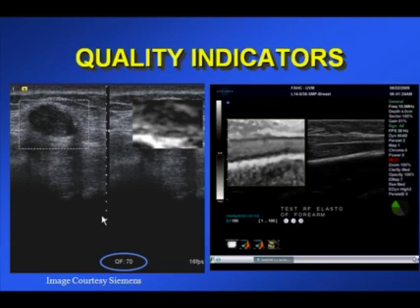And most of these are based on the mathematical algorithms used and a numerical quality assessment that is performed by the imaging system. For example, the Siemens system gives you a numerical readout of quality factor, and for quality factors above 70, it produces an image and allows you to assess it. For quality factors below 70, the image is grayed out so that it can't be used for diagnosis. The ultrasonic system on the right uses a pie chart, and the goal is to have as many of the pie shapes lit up in green as possible. The more pie sections that are lit up, the higher quality the elastogram is. So it's important to have this available in any system so that you can use that to assess which of the images you should be looking at.